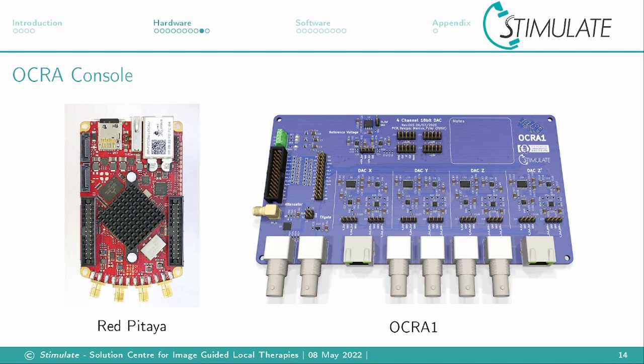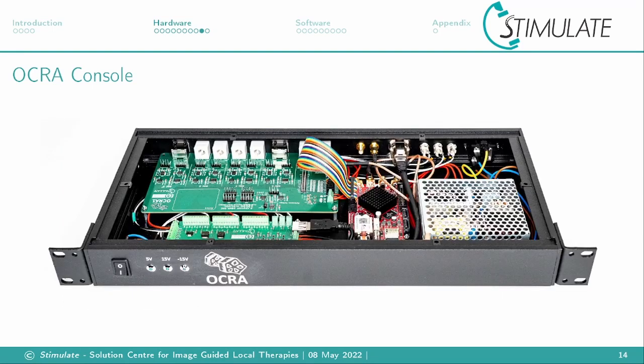The external hardware is mostly the OCRA 1 board, which contains four 18-bit low jitter digital to analog converters for the gradient waveform generation, but also an RF attenuator to scale the Red Pitaya output to the RF amplifier input. This is the inside of the console.